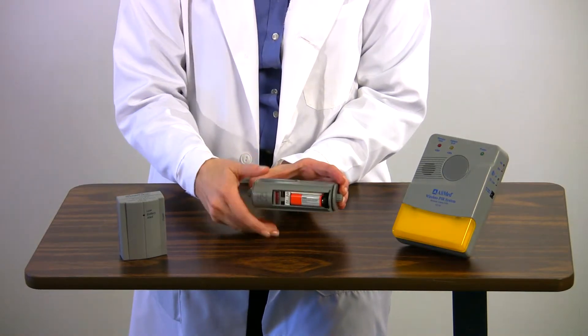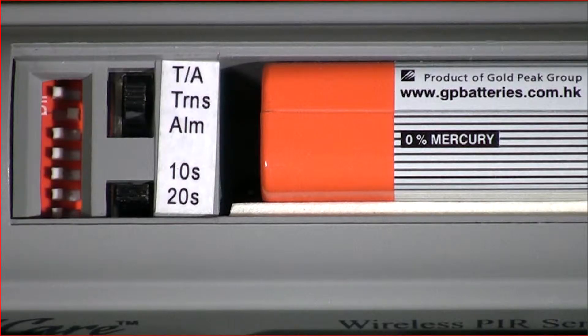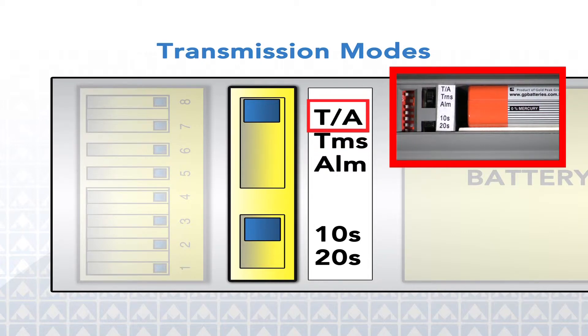The unit swivels in the holster to expose the battery compartment, where you'll also find the transmission mode controls. Three choices can be made from the transmission mode using the selector switch. Choose alarm if you want only the alarm to sound with no signal sent to any other device — use this mode when using the PIR alarm alone. Choose transmit when you want the PIR alarm to transmit only to other devices and not emit an alarm sound itself; use this mode when trying to avoid waking other patients in the room. Choose transmit and alarm if you want the PIR alarm to sound both locally and transmit to the remote receivers, alerting staff outside the room as well as warning the patient that they have triggered the alarm.